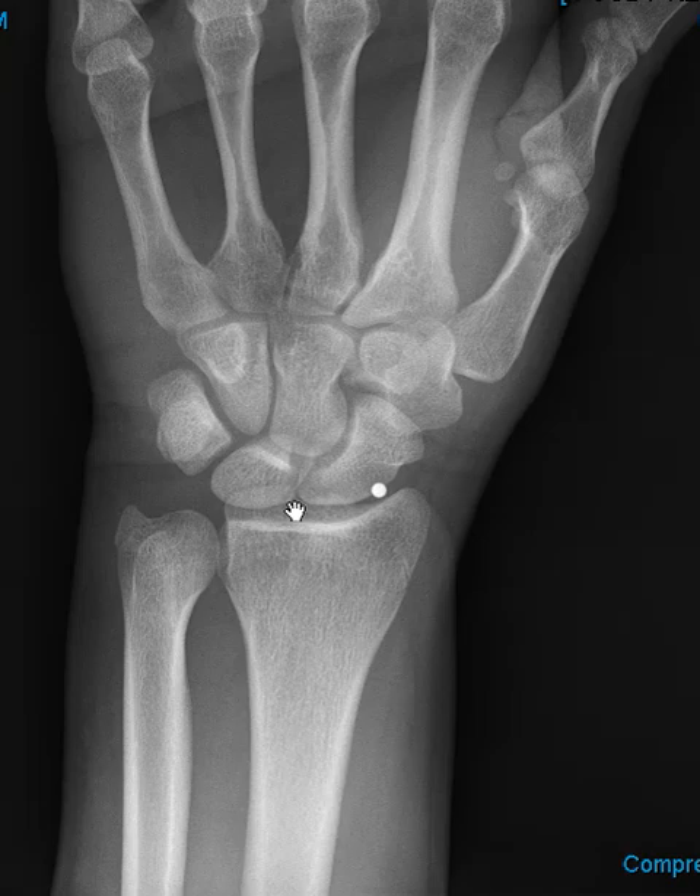You've got to be careful not to go too far in here, because you can easily go on the other side of the ligament. There's a scaphoid and a ligament — if you go too far that way, you may be on the other side and the contrast will go into the mid-carpal compartment.